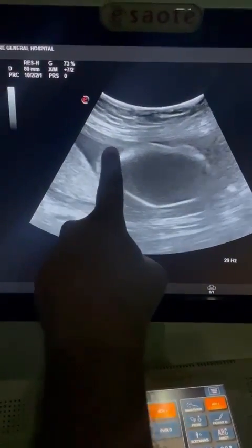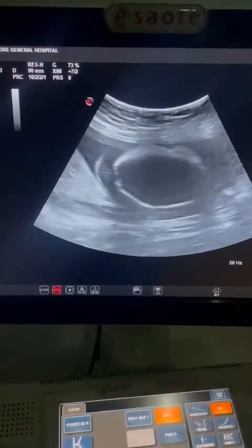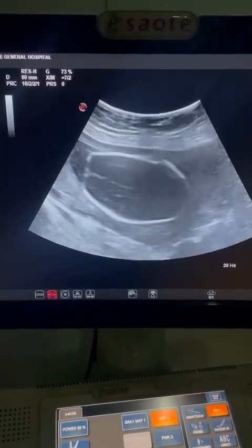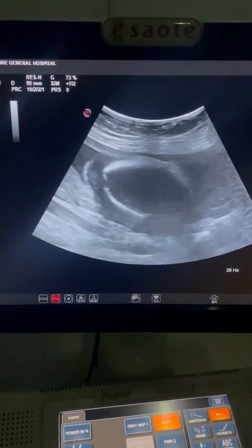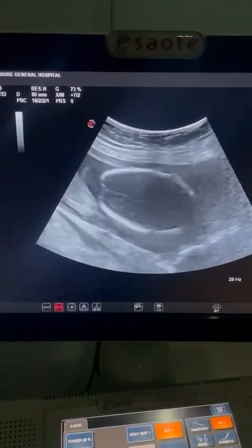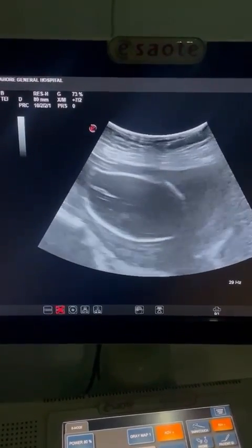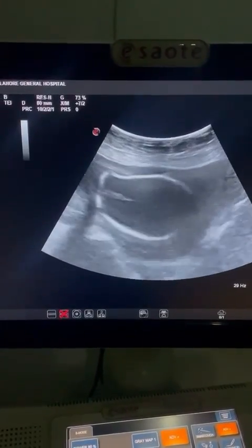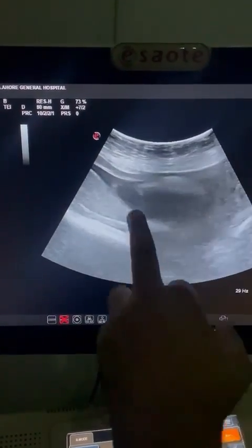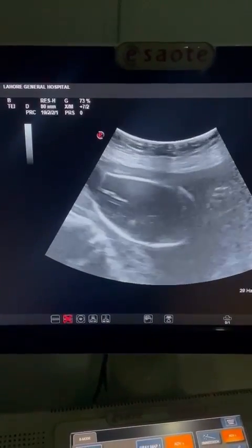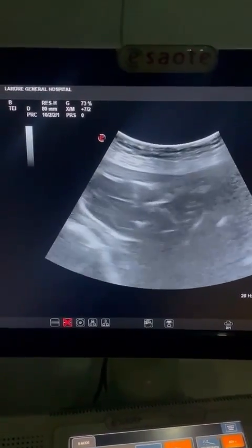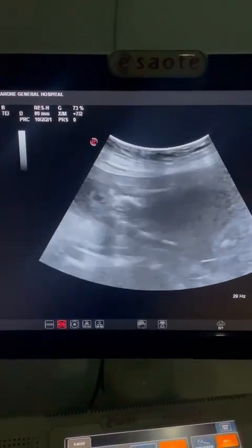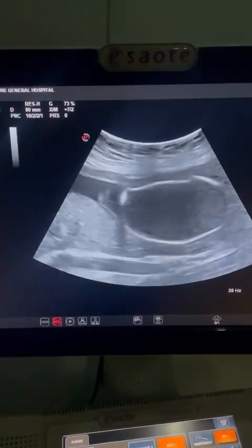You can see that this is an anomalous head and a mass is protruding from the frontal part of the skull bone. The head shape is elongated and oval-shaped. Spalding sign is very evident in this video — the bones are overlapping each other — which indicates this can be an IUFD.